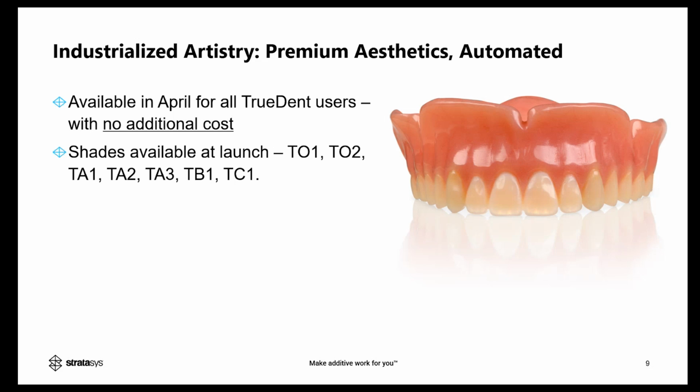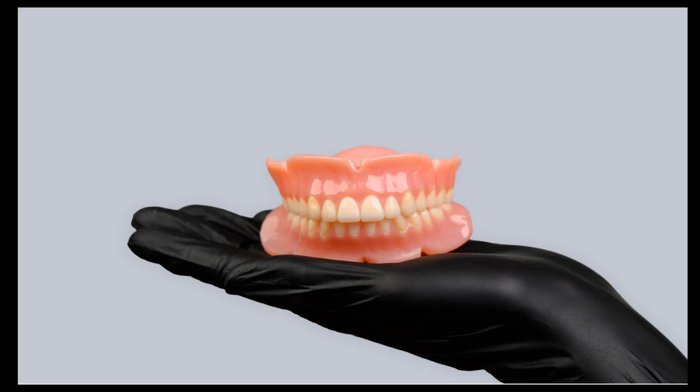As usual, we're going to be able to make the offering larger through a software update with no additional cost down the line. And I prepared, I hope, a quick demo of how to use the software, and I'll try to explain along the way. Adrian mentioned there's a Q&A box. Any questions you have, throw it in there, and I'll try to get to it when I can.